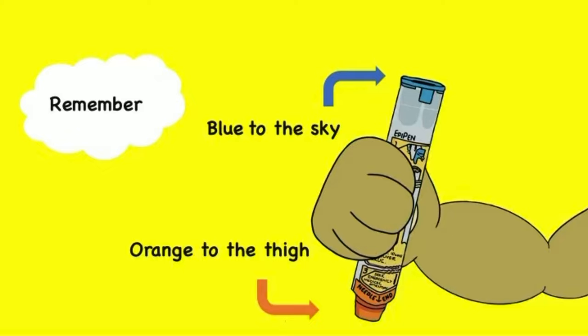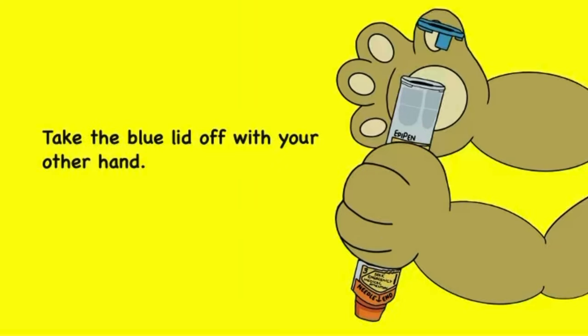Remember: blue to the sky, orange to the thigh. Take the blue lid off with your other hand.